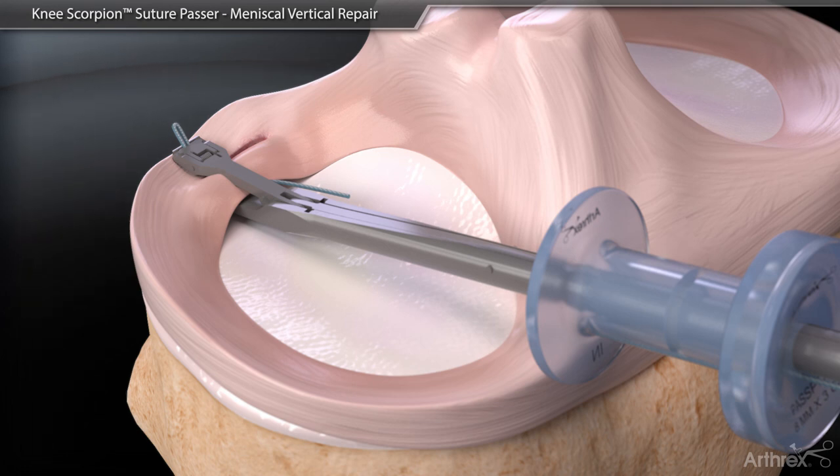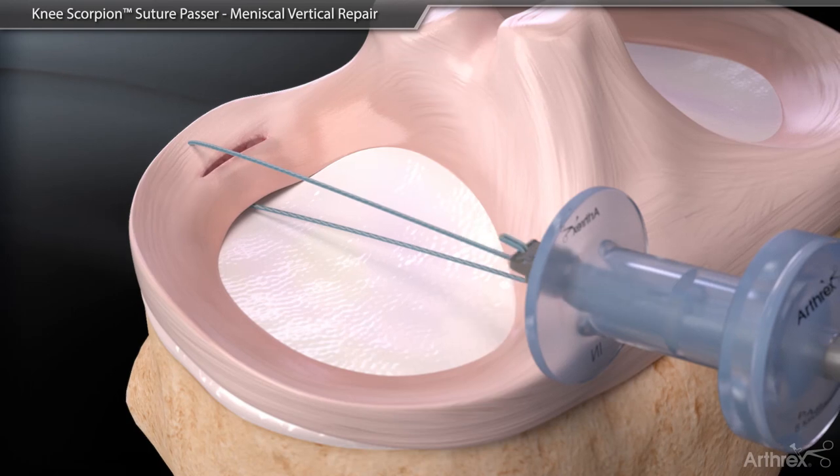With the suture secured in the top jaw, pull the instrument back through the passport cannula.